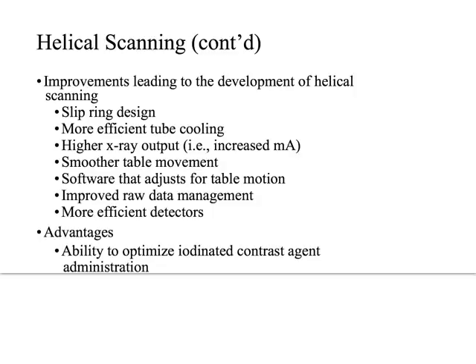So here's some of those things that we outlined. It looks like the slide didn't include quite all the advantages in here, but this is definitely going to enhance our ability to administer contrast and be able to have it all in the same phase so there's no washout. We can scan more quickly. And then, like I've mentioned, the data set that we have, we are going to be able to think about three-dimensionally. We will be able to do computer processes on it that are three-dimensional in nature.